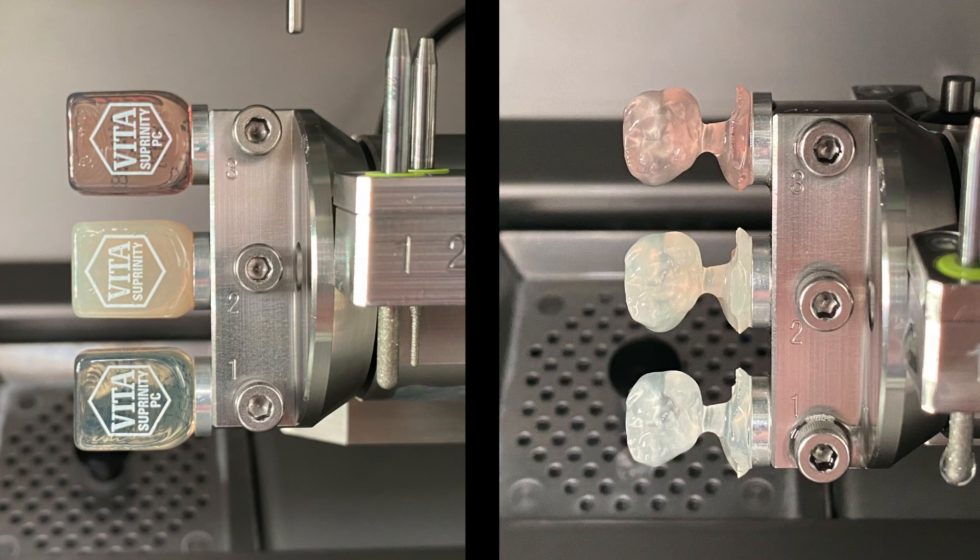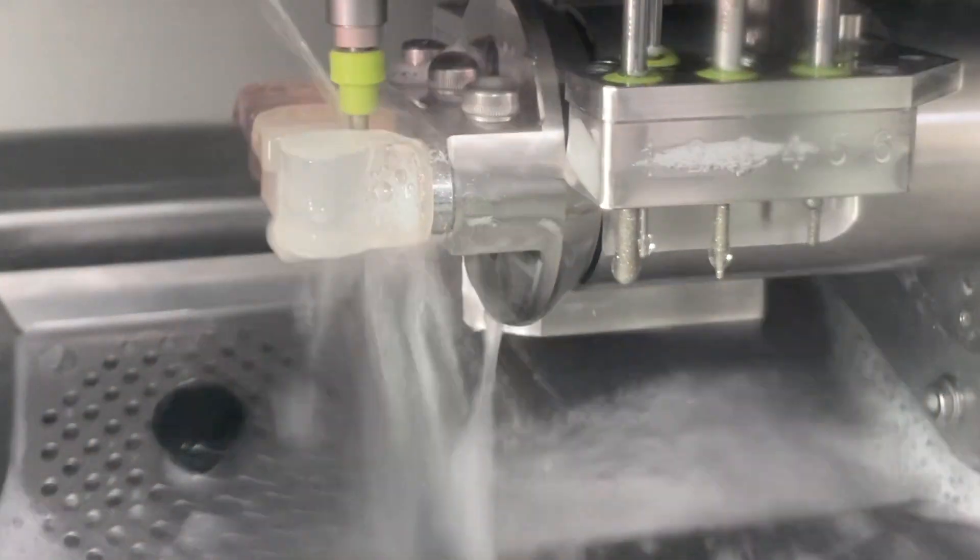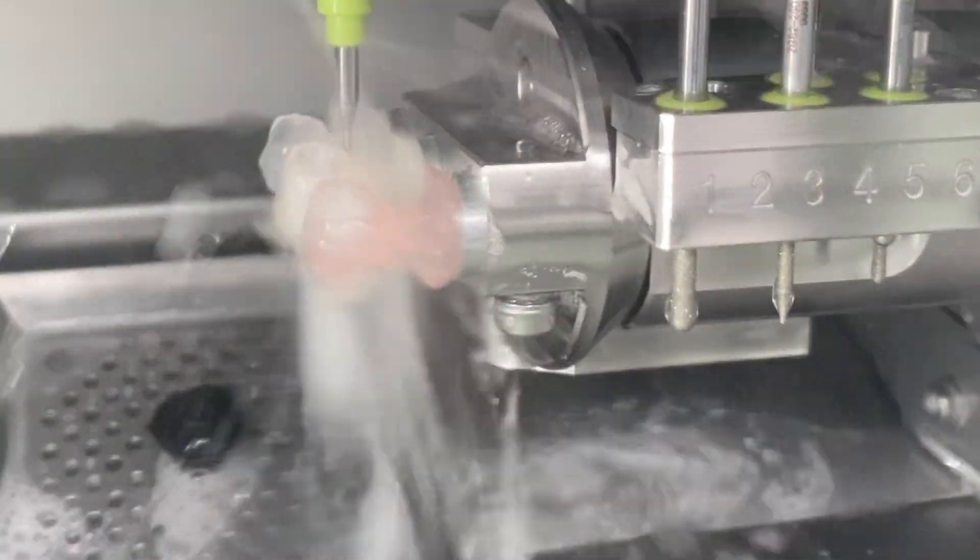If you're looking to mill beautiful crowns or veneers, look no further. Vida Suprenity blocks allow for fast milling and polishing. Suprenity is made from zirconia reinforced glass ceramic and it's strong with high precision due to its high edge stability.